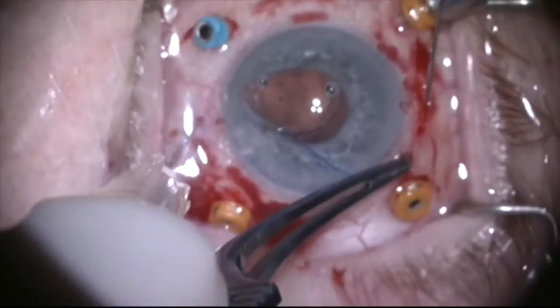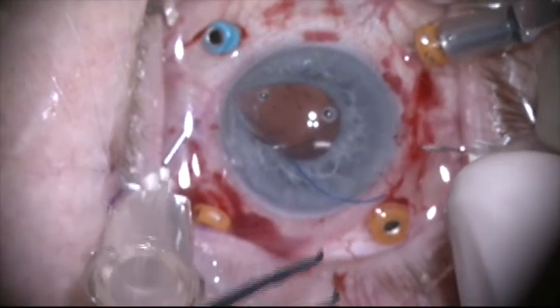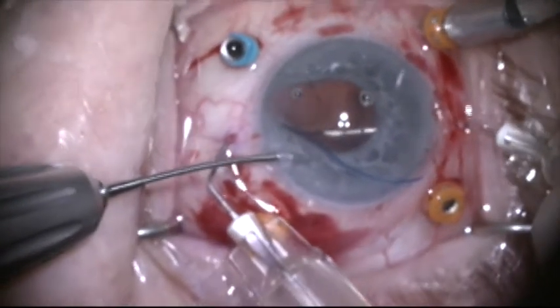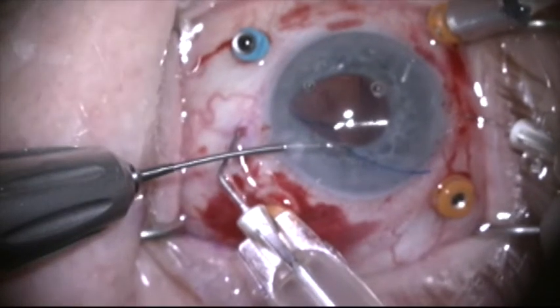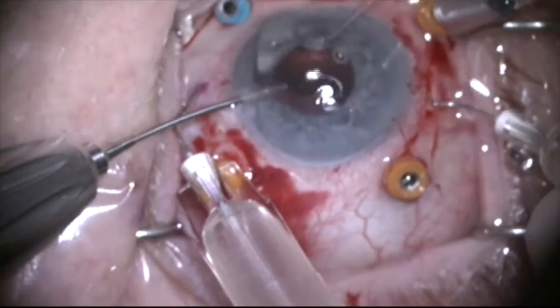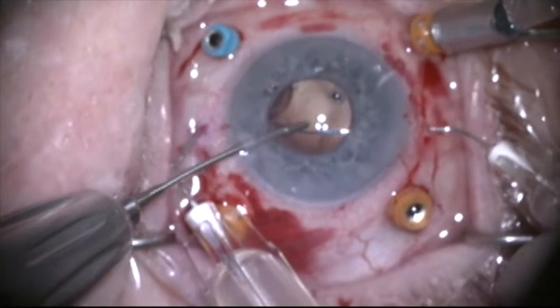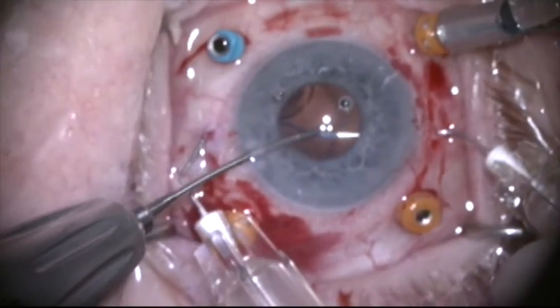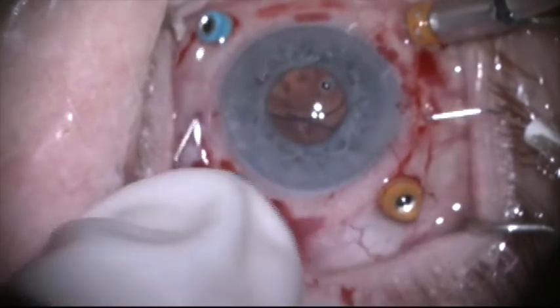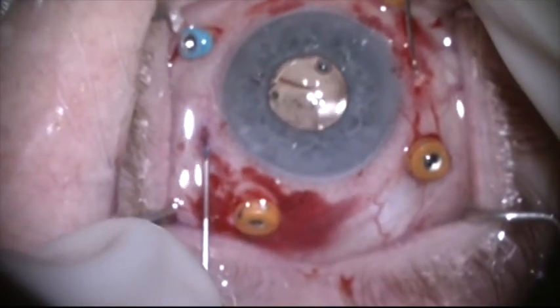Once the haptic is in, it'll be held in place by friction. I'm now going to place a second 30-gauge needle exactly 180 degrees away — it's very important that these are exactly 180 degrees apart. I'm going to grab the second haptic with the same 25-gauge forceps, pushing the optic away a little bit with the needle so I can get it at the right point at the curve of the haptic. With both haptics docked into the 30-gauge needles, I'm going to pull both haptics out of the eye at the same time, which will rotate the lens into position.